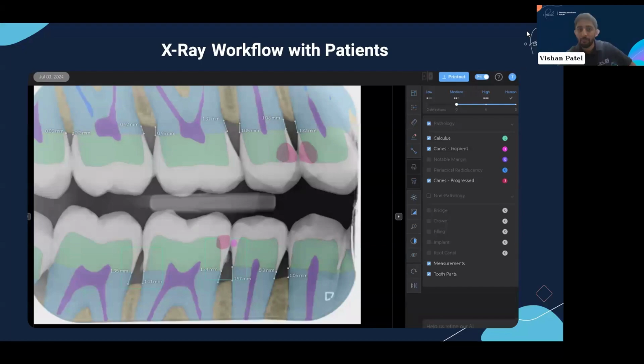So yeah, here, as you can see on the top right area, this is the sensitivity bar. You've got low, medium, high, and then you've got human, but you can essentially change this. Low detection is low detection of everything, and then high. I always just need it on medium, to be honest. But yeah, it's defaulted.